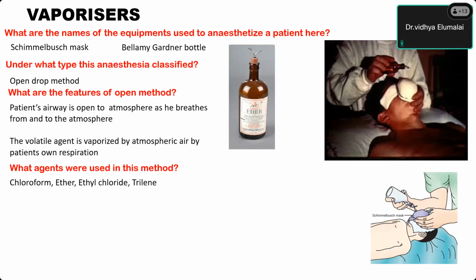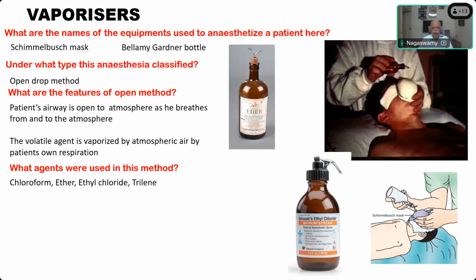No, sir, not at all. Okay. It is also one of the obsolete or old-time anesthetic agents. The ethyl chloride bottle will look like this. Okay, and you can see it has got a lever-like thing here, and this is the cap which is closing that. This is the bottle plastic cover. On top of that, there is a small projection with a hole, and that hole is covered by this cork-like thing which is attached to the lever. If you press this lever, can you guess what will happen? Why is this sort of arrangement there? Anybody knows what is the boiling point of ethyl chloride?